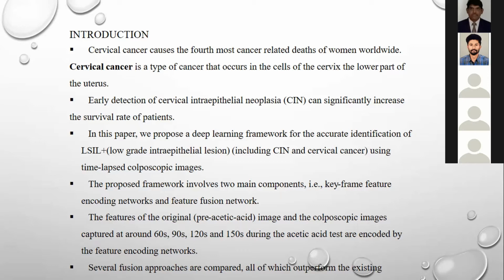In this paper, we propose a deep learning framework for accurate identification of LSIL, which is low-grade squamous intraepithelial lesions, including CIN and cervical cancer, using time-lapsed colposcopic images. By using those images, we are going to predict the cancer rate.